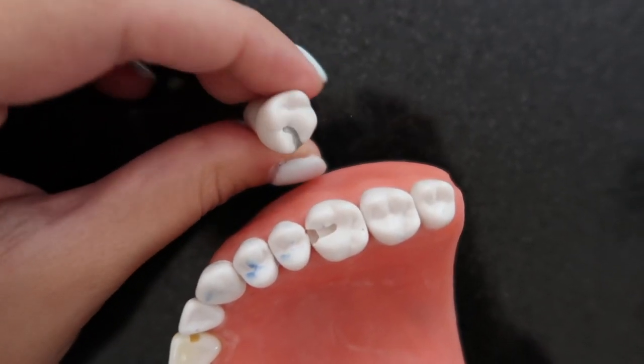Let's start talking about how to actually prep a good quality class two prep. Sometimes on bench tests they will tell you they want you to prep and fill a type two preparation, type two cavity. Most of the time they will just tell you to prep, because if your prep is good your filling will hold well. Sometimes they tell you to prep for amalgam, sometimes for composite — there are slight differences but they're very subtle.